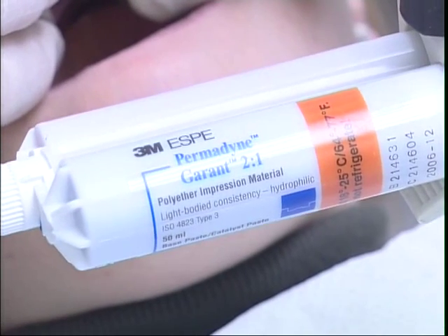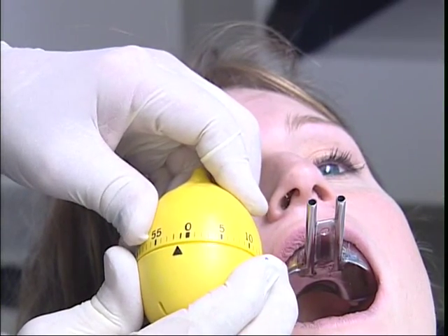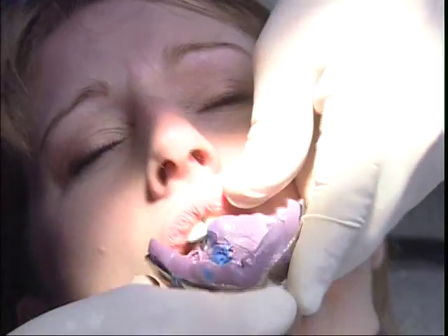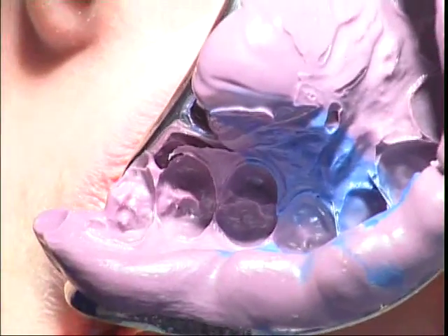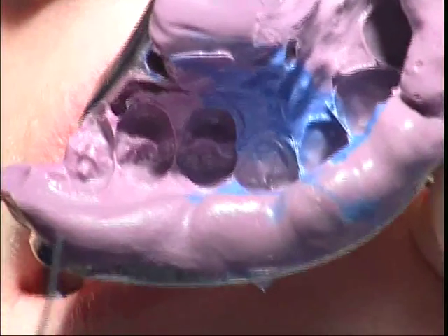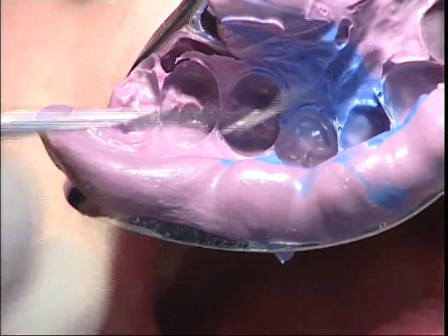This is the syringe material. The patient is sitting there for a couple of minutes and it doesn't taste that well. And you can see the matrix band clearly showing on each side of the prepared lateral. These will now help to separate the dies in the lab.